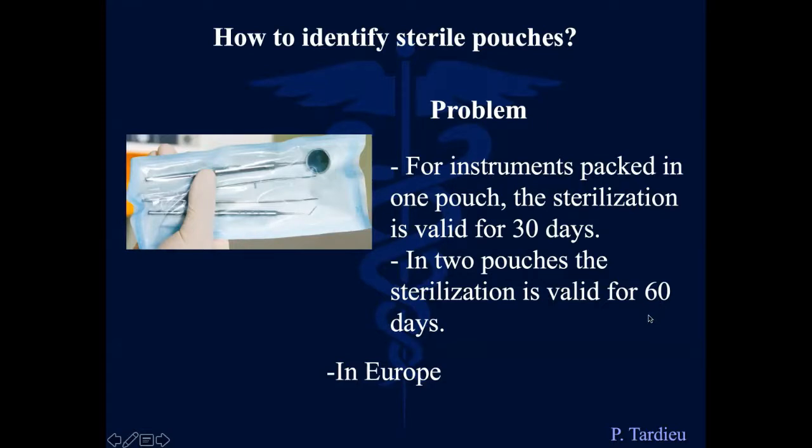We've been looking around here and there, and we didn't find any rule for sterilization validity in UAE. So we can consider that it might be valid for 6 months, 1 month, 1 year, nobody knows. So right now it's empty, but we will have the information because the Ministry of Health is working on that, and they are going to say here the validity of one sterile pouch is, let's say, 30 days, 60 days, 180 days.